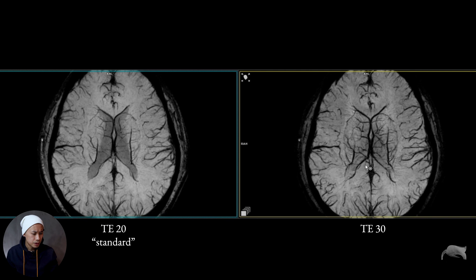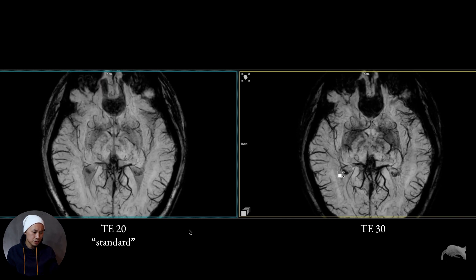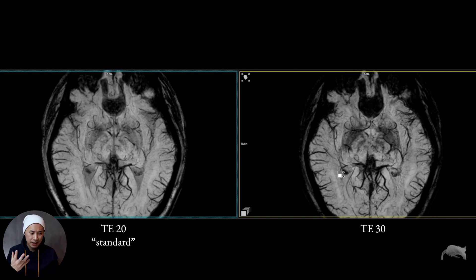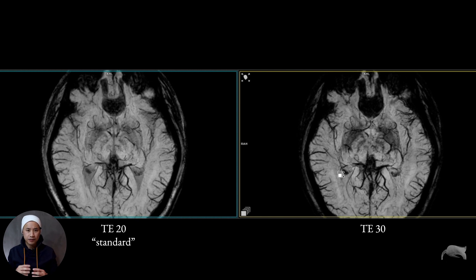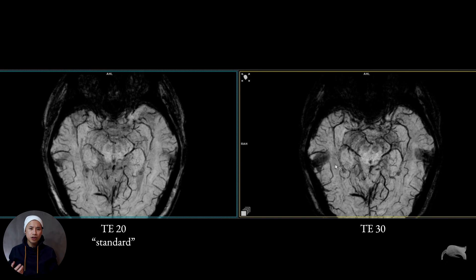But there are pros and cons. Look at the small vessel right there — it comes much more forward on the modified side compared to the standard. This one looks much, much better of course. But there is one con: the susceptibility enhances, which means you also enhance the artifacts — which you usually don't want. There's a small artifact right there. So I can see a problem whenever it comes to metal artifacts — from a dental filling, for example — it will be a problem. Also at the air-tissue interference area. But nevertheless, the small vessels come through much better. It's very difficult to see on the other side. So it's pros and cons — just remember that.